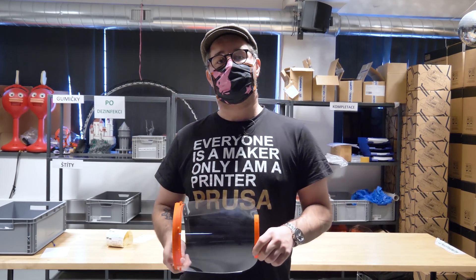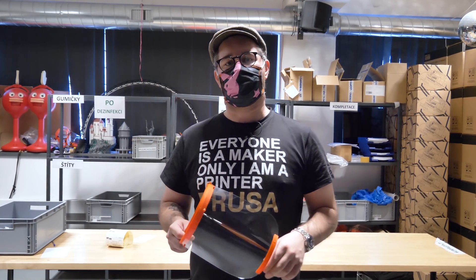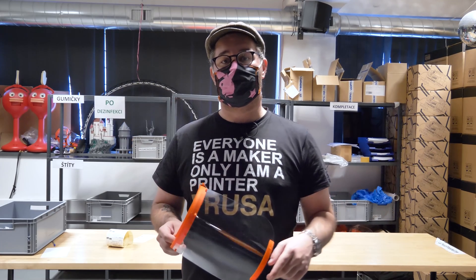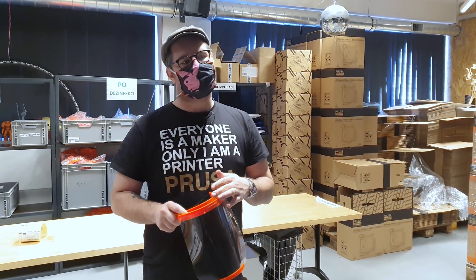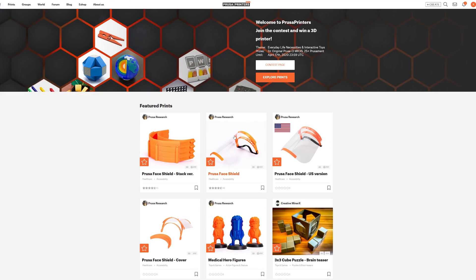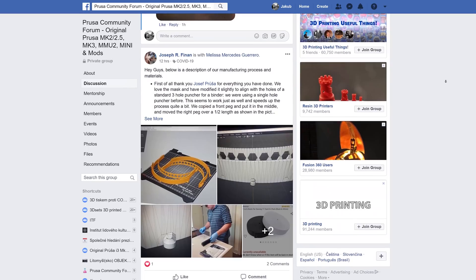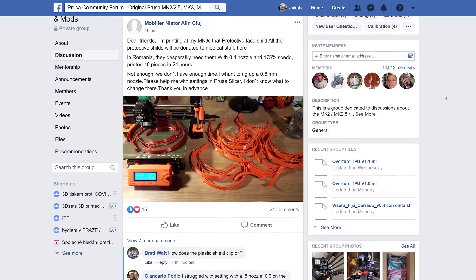The face shields are great because they are an added layer of protection against very large particles. If a positive patient, for example, coughs, it protects the face and also extends the life of normal respirators. This is our already third iteration based on doctors' feedback, and we decided to publish it as open source on our Prusa Printers website. In just a couple of days we've seen them being printed all around the globe, helping locally and helping the doctors.